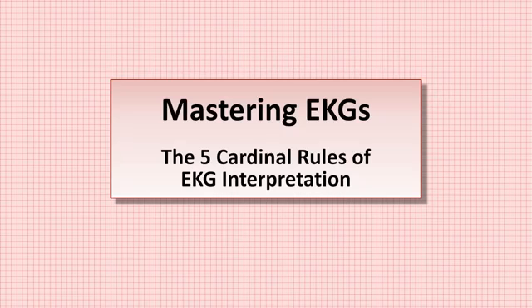Today, I'll be talking about my 5 cardinal rules of EKG interpretation. This video will assume you already have some basic knowledge of EKGs, like what different waveforms are and how to determine the intervals in the axis. If you know nothing about EKGs, you may want to check out some of my other videos first and come back to this one later.